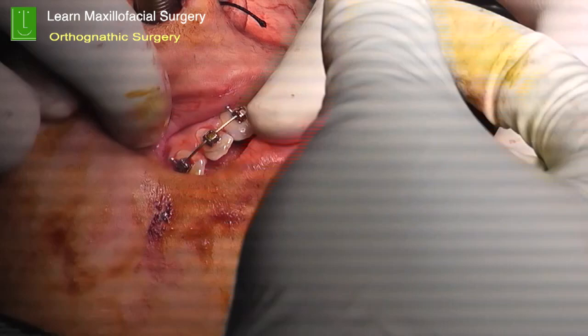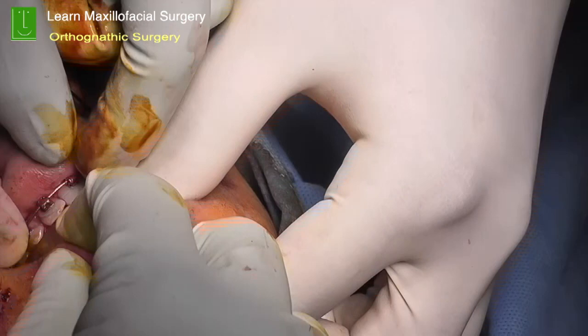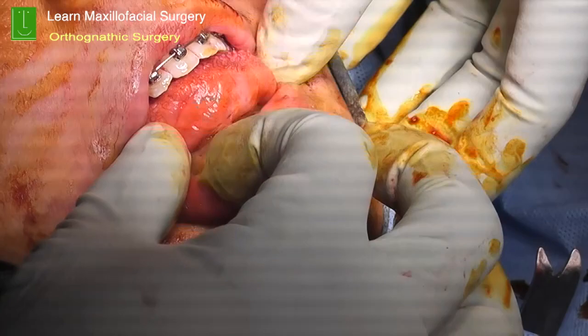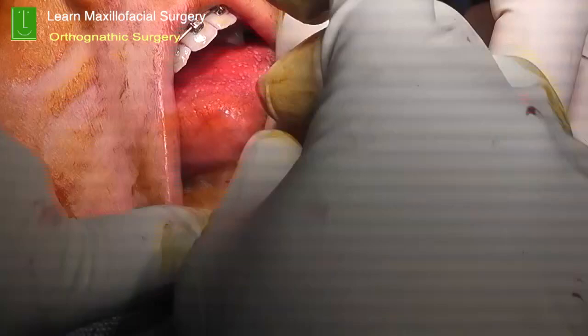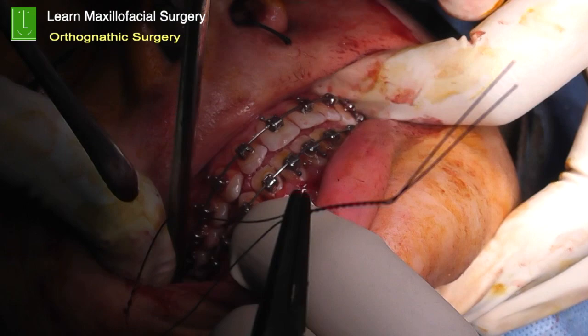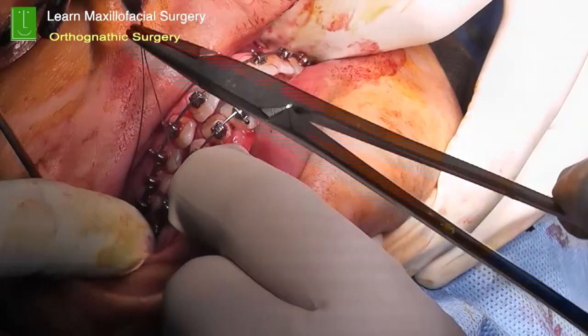It snaps into position. Sometimes the tongue comes in the way, and that's where you need to use a Howarth's periosteal elevator to push the tongue back, and you're able to basically get the teeth into intermaxillary fixation. This is a key thing, because ultimately everything depends on the kind of occlusion which you would like to get, and a splint can be very, very helpful in terms of getting the right position. So using fine wires, you're putting the teeth into intermaxillary fixation.